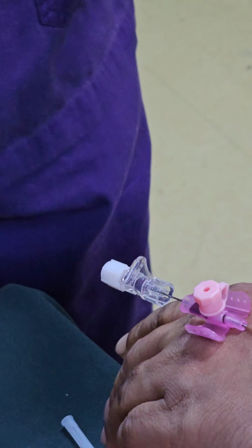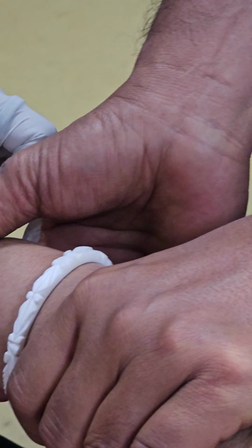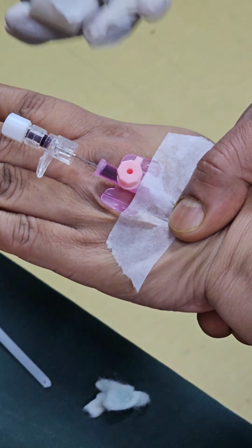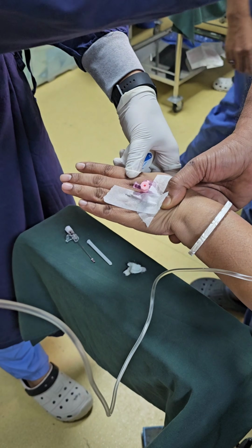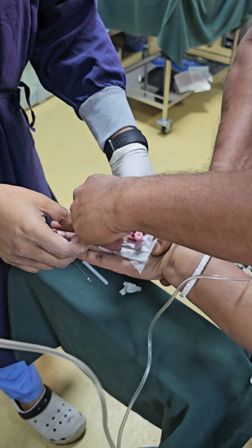And then we secure it with micropore tape. The person who is holding the hand is causing a blockage of the venous drainage to increase the tortuosity of the vein, which is performed from the beginning of the cannulation process.